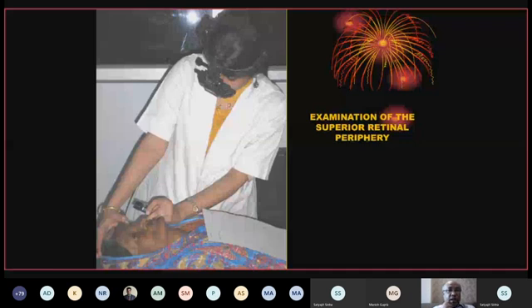And also one small point what Dr. Pooja said, darkened room. Do not keep your illumination very bright the moment you start. Keep it on the lower side. Once you see the patient is a little bit comfortable and coordinating with you, then maybe you can increase the illumination a little bit more. Starting with a high illumination and then reducing it when the patient is uncomfortable is sometimes very counterproductive. Then you've lost the game over there.